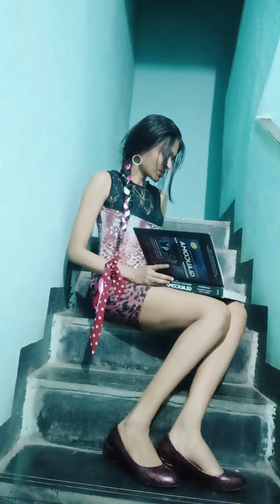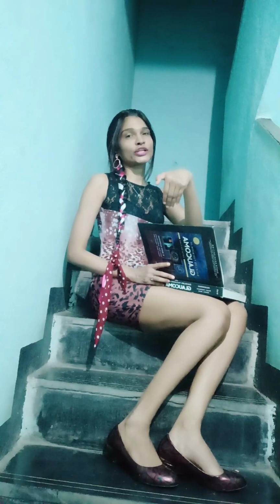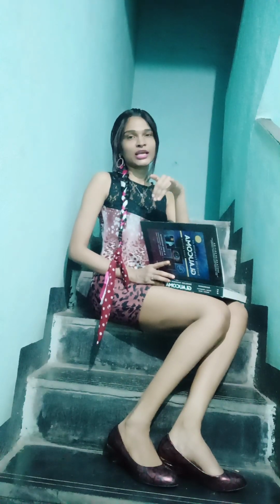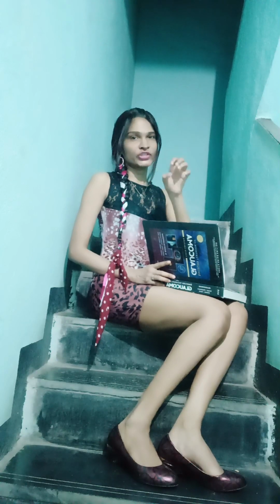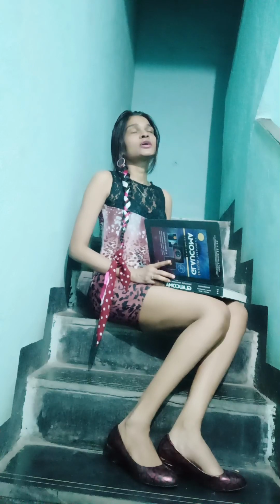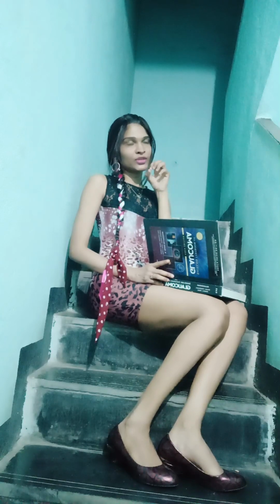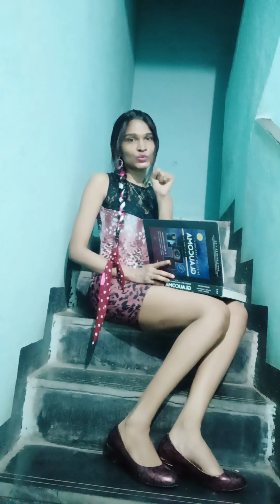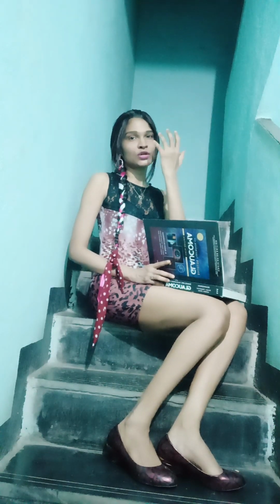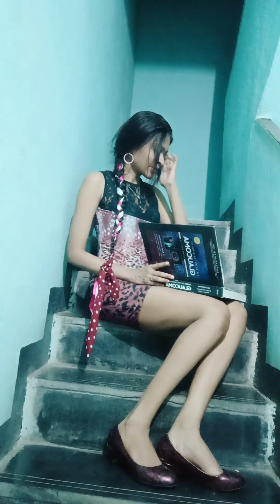So this Koeppe lens has an anterior curvature that is steeper than the cornea to reduce the angle of incidence to less than the critical angle, so that the critical angle is not reached. Then the posterior curvature is available in different diameters. When the posterior curvature is steeper, we need a bridging substance like methylcellulose or balanced salt solution to fill the gap between the cornea and the contact lens. So that was about the structure of the Koeppe lens.